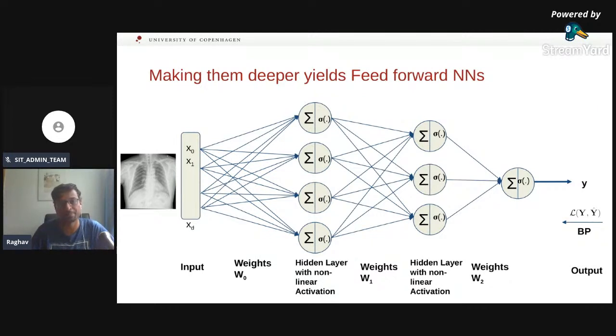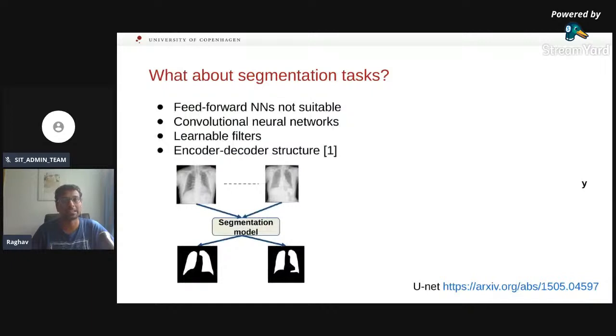what deep learning is. Now, we are trying to do segmentation of lungs, right? We want to go from lungs to lungs. You can do this using feed-forward neural networks also. But there's a lot of other literature from computer vision, where you can end up seeing that feed-forward neural nets are maybe not the most useful, because computer vision has always done filtering, right? You can do a low-pass filter and a high-pass filter, for instance. That's one way. And then you can do Gaussian smoothing to learn some interesting features, etc.